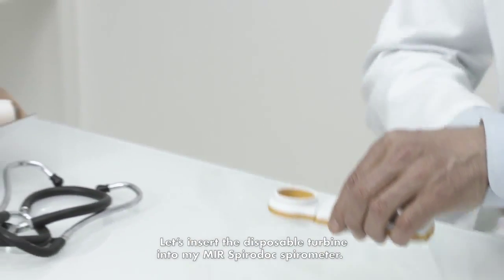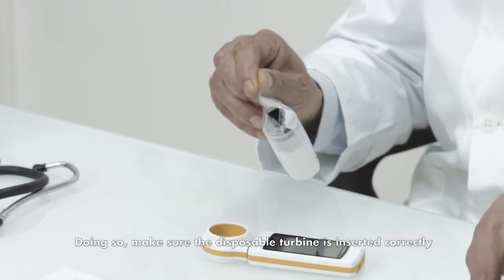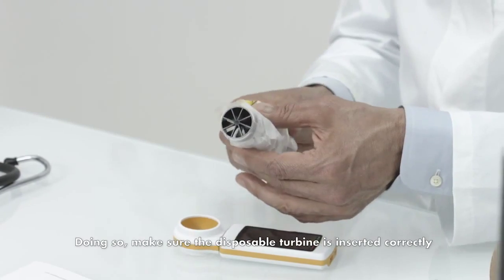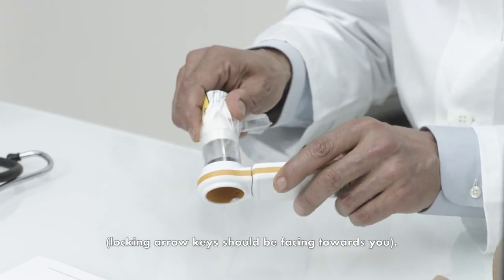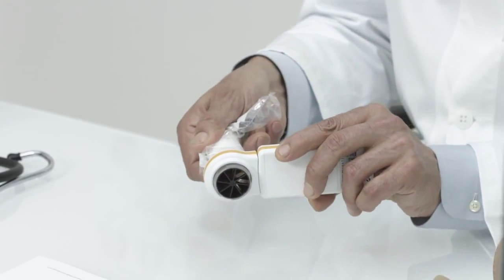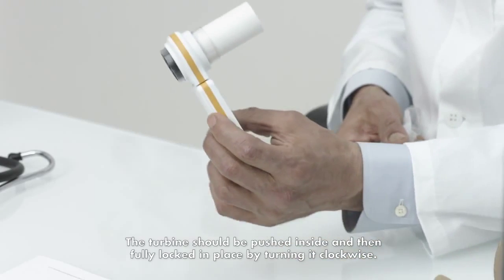Let's insert the disposable turbine into the MIR SpiroDoc Spirometer. Make sure the disposable turbine is inserted correctly. The locking arrow keys should be facing towards you. The turbine should be pushed inside and then fully locked in place by turning it clockwise.